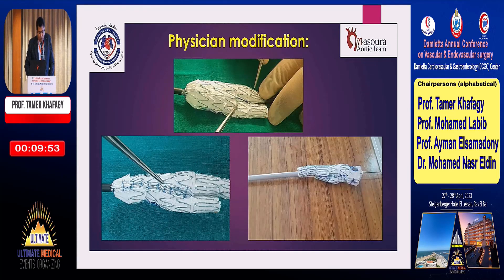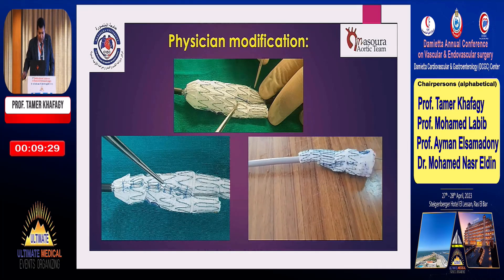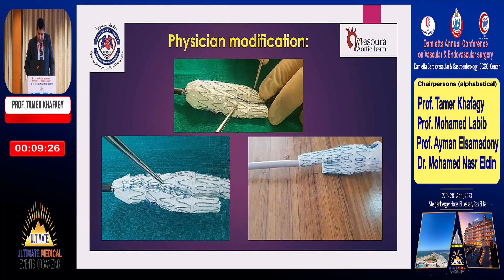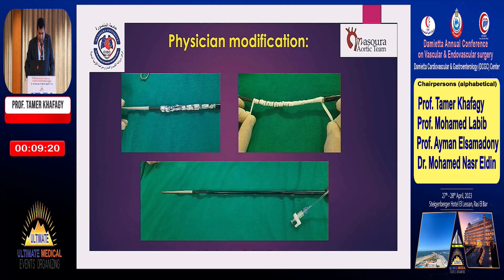After doing the diameter-reducing ties to construct the graft, the graft opens in two stages: first we open the graft, and after positioning of the branches, we open the diameter-reducing ties. This video shows how, when the wire is extracted, the diameter-reducing ties open. After the diameter-reducing ties, we can restrict the graft with silk sutures and nylon tape so we can reduce it to fit inside each sheath.